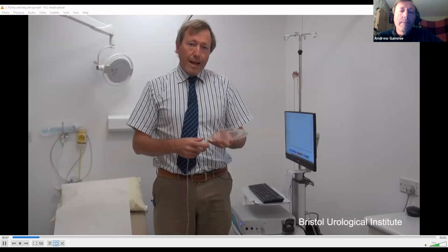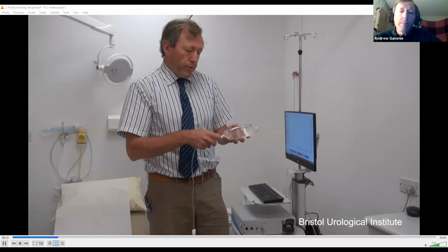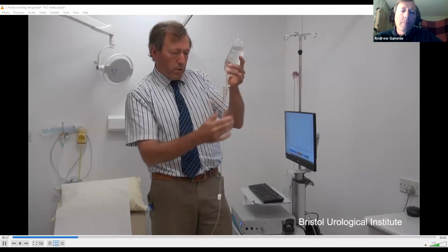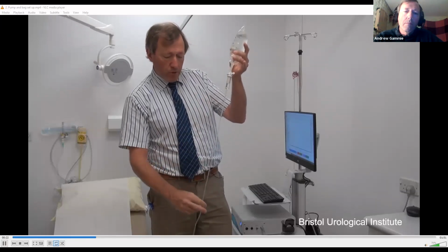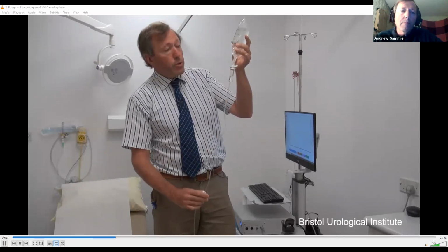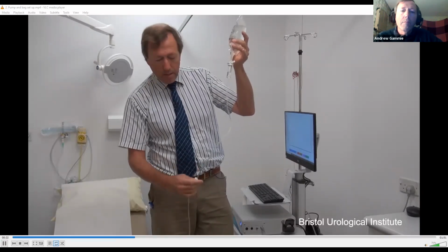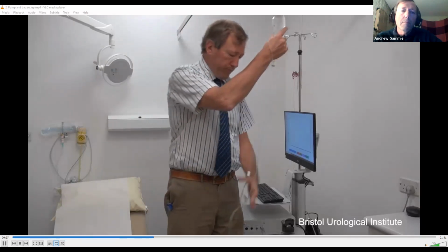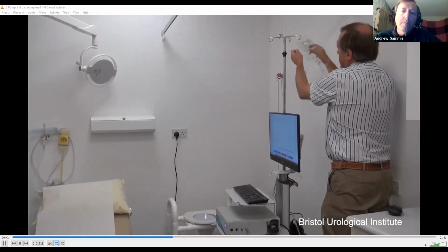Now we'll mount the pump and the giving set so it's ready for the patient when they come in. I've got the giving set into the saline bag, and to start with I'm going to give a squeeze to fill up the chamber halfway. I then open up the tube so that I can allow it to run through and fill up the whole tube so that I'm not putting air into the patient. And when it's coming out at the end, I can seal that off and bring it over to mount onto the pole, which we have above the machine here.